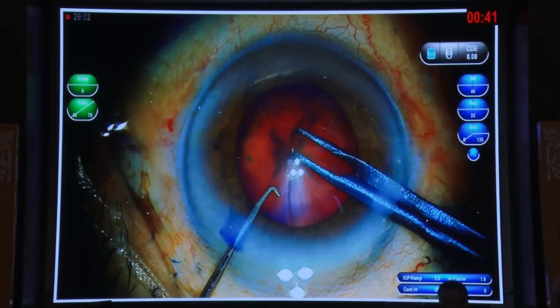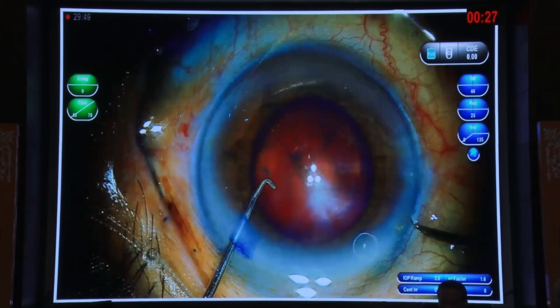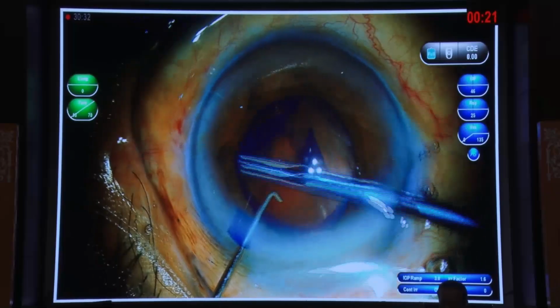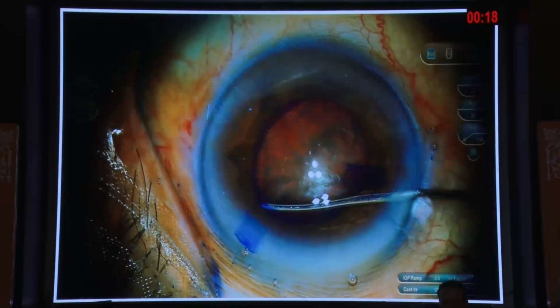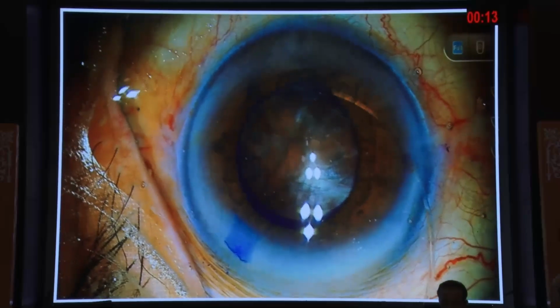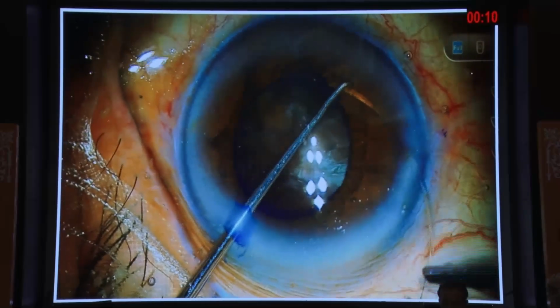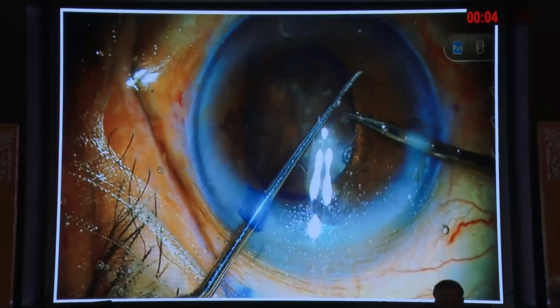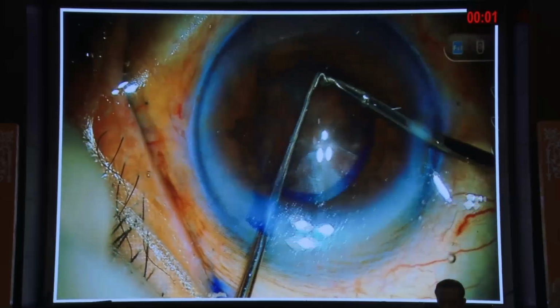Now this is a much commoner case which you face during surgery, because if you already know that there is a subluxation, you are better prepared to manage that case. But this is more often what you see in practice, because you have seen this patient pre-operatively, but you have not judged how much the zonular dialysis is. So here you can see it is a diffuse zonular weakness, which you typically see as wrinkling of the anterior capsule when you start the capsulorhexis. So in such cases, how should you manage? This is also a brown cataract, and in many of these cases, they have a very hard cataract. So in this case, I will go with the CTR first approach, because I want to support the bag completely using the CTR. But again, you have to always keep in mind that this is just redistribution of the zonular strength.